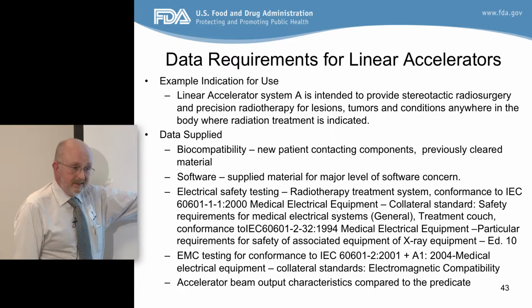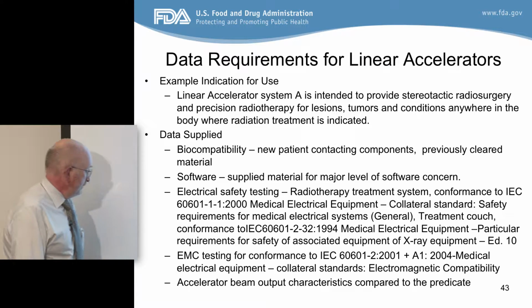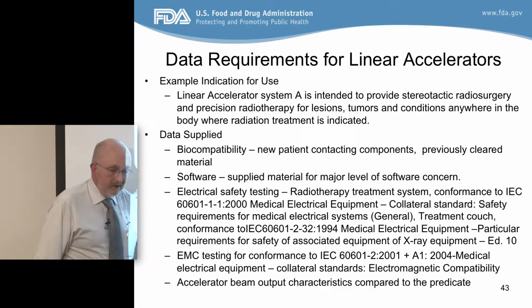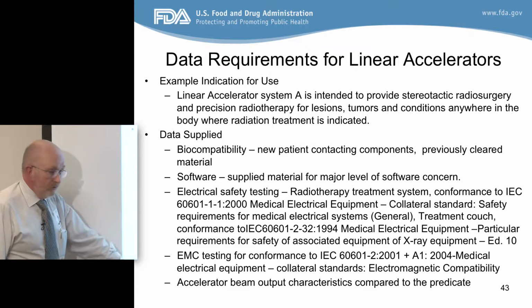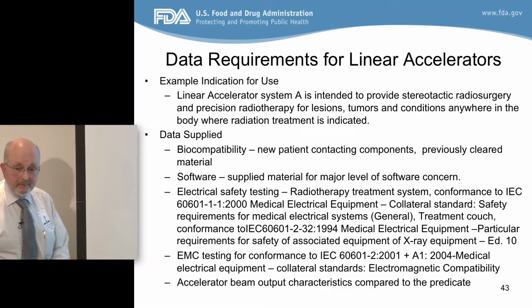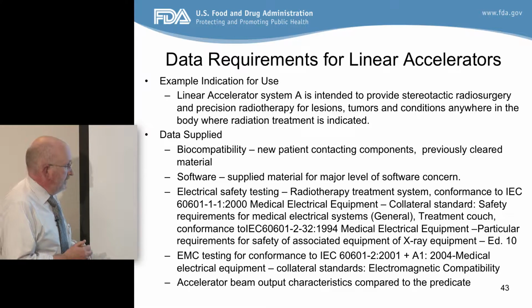Electrical safety testing, EMC testing, and all of the dosimetry issues that any good radiation oncology physicist would want to see. So we go after those all the time. We're always looking at that data.